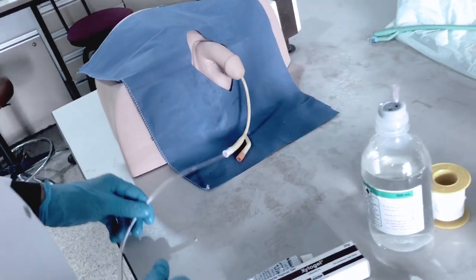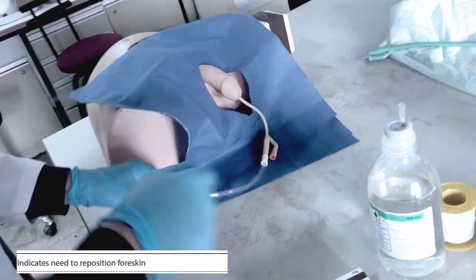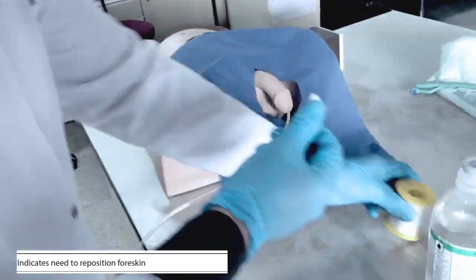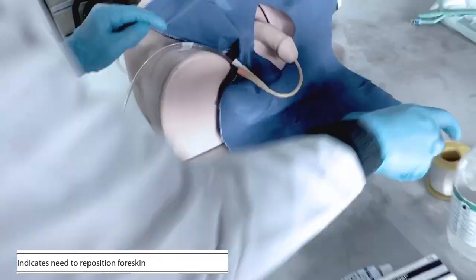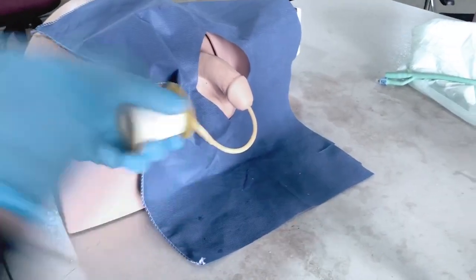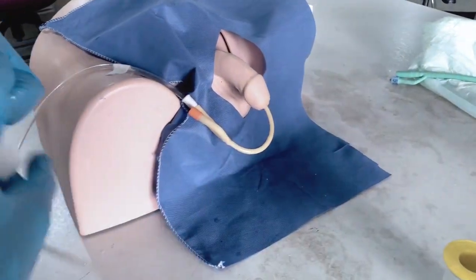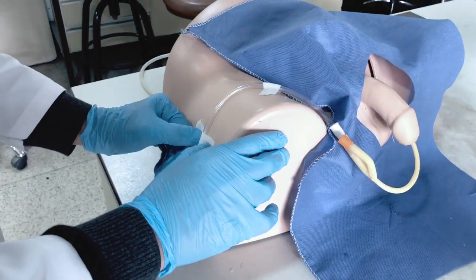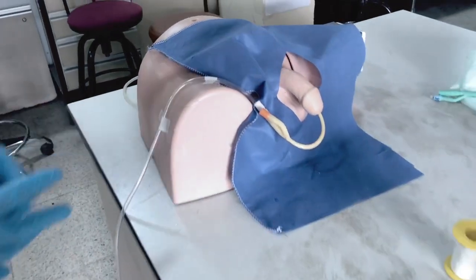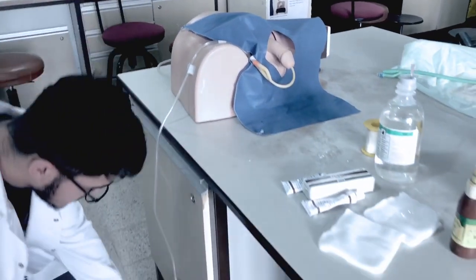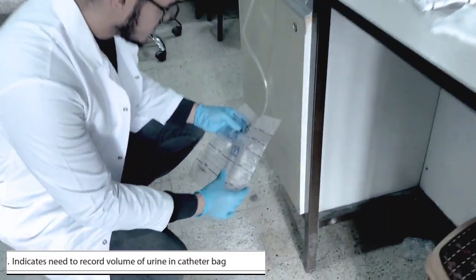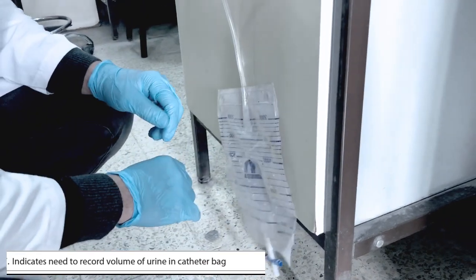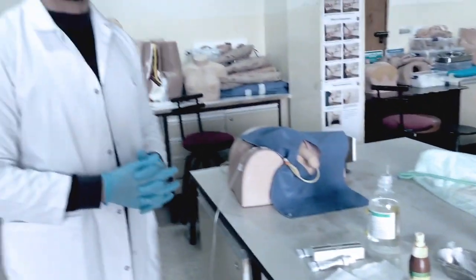Then we tighten the catheter and fix the catheter with tape, and then thank the patient.